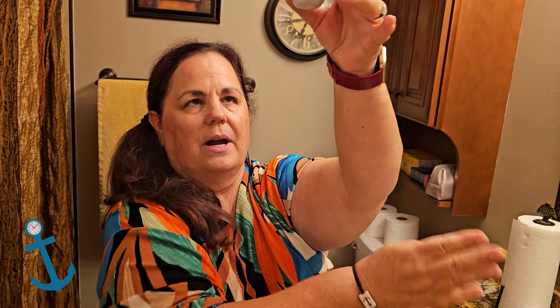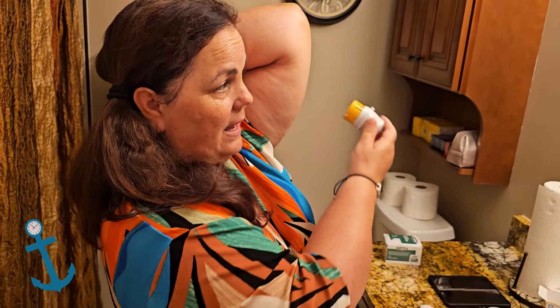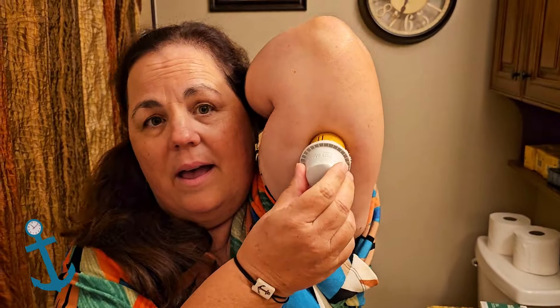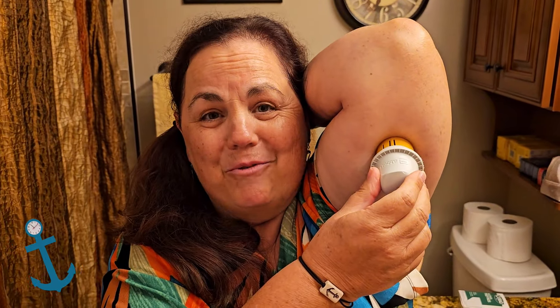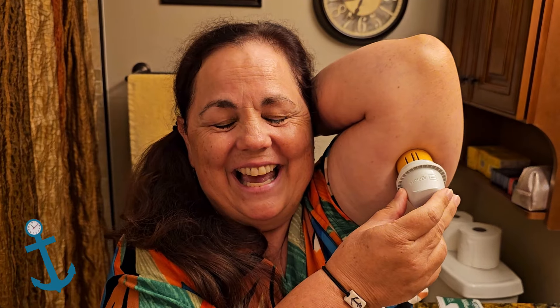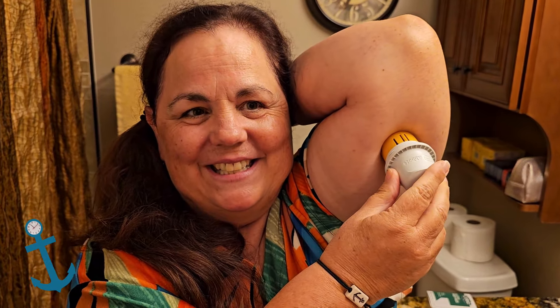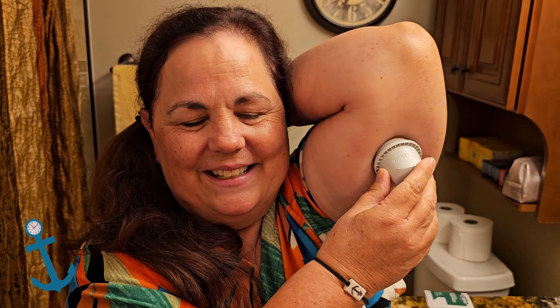I think my arm's all dry. All I have to do is take this and place it on a clean spot of my arm. Hopefully it won't hurt — the Libre 2 doesn't hurt, and the Libre 1 didn't hurt, so probably the 3 doesn't hurt either. It does look a little bit different but it's not supposed to hurt. So here we go — one, two, three!